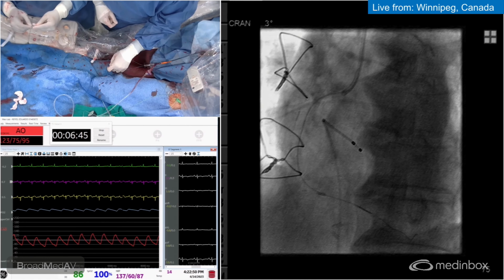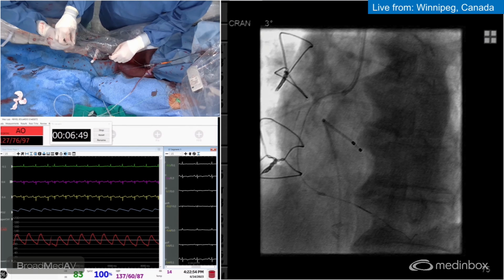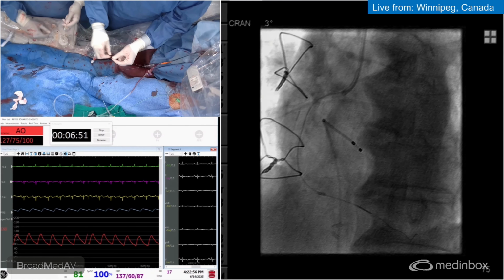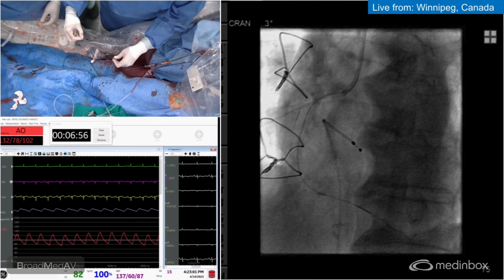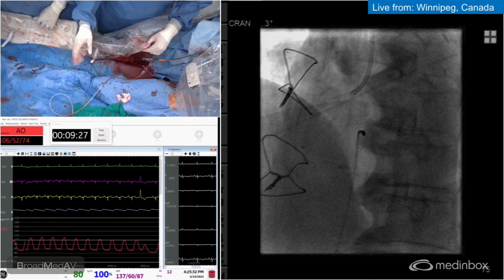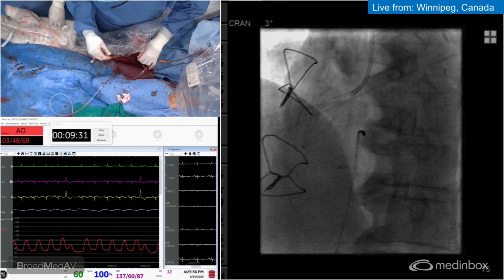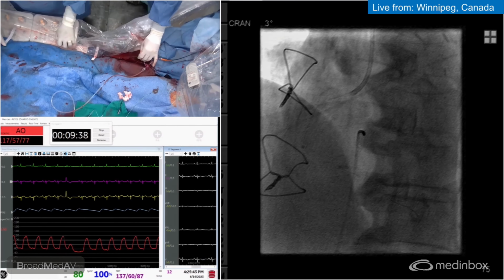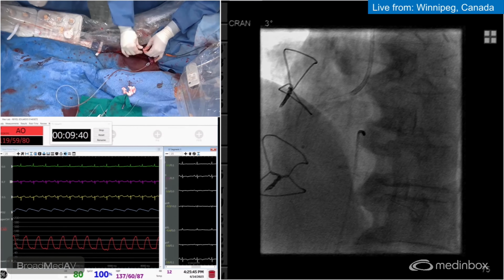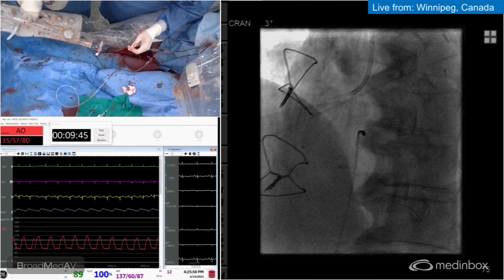So a wiggle wire is a support wire that's got a few bends on it. The idea is that these bends will keep the wire and the system anchored more distally, and it'll keep the delivery part of the wire more centered away from the wall. So our problem was not expansion. Our problem was interaction. So the wiggle wire managed to keep everything more central and anchored it distally, where the guide extension flew down there up until the distal lesion. So I'm hopeful this should be enough to deliver the stent.